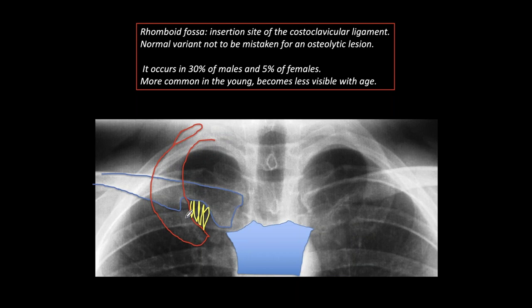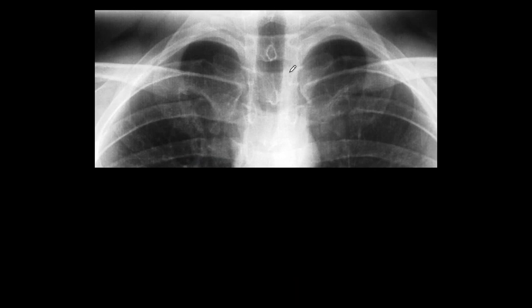It's a normal variant and should not be mistaken for an osteolytic lesion. It's not uncommon — it occurs in 30% of males and 5% of females, and as we get older it slowly disappears. Let me show you some examples. Sometimes it's unilateral, other times bilateral. Here we have a bilateral rhomboid fossa, a small one on the left and a larger one on the right. Notice the persistent sclerotic border, which is the hallmark of this lesion.